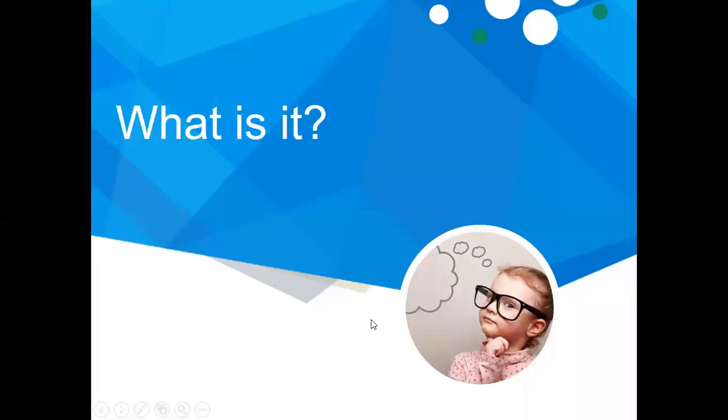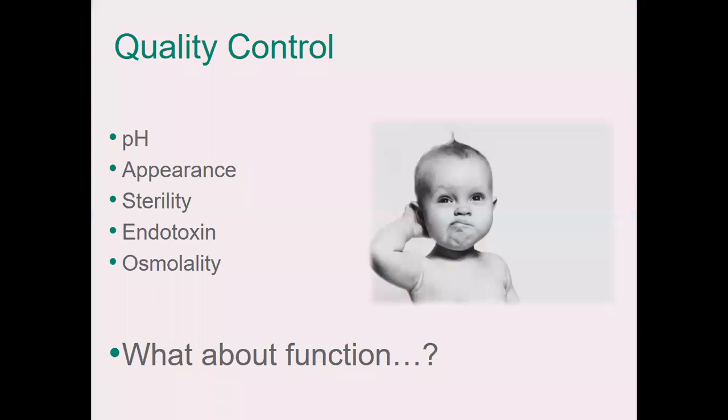As I mentioned, the topic today is called MEGA. So the question is, what is it? It's about quality control. In this field, for equipment, labware, and media, before any product leaves the company, we need to do quality control.